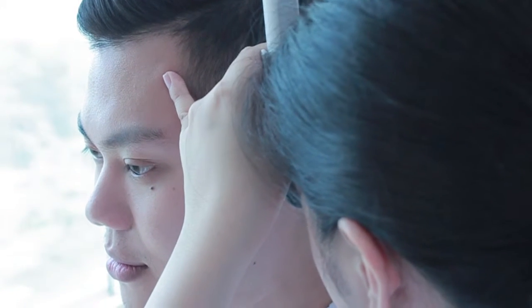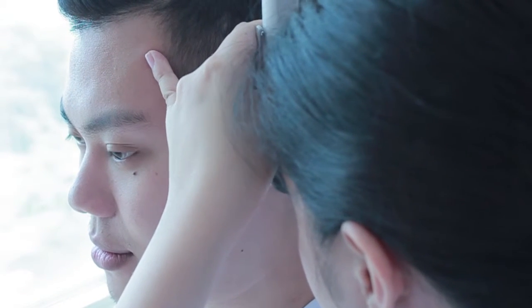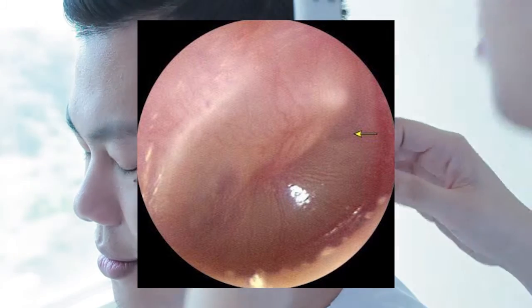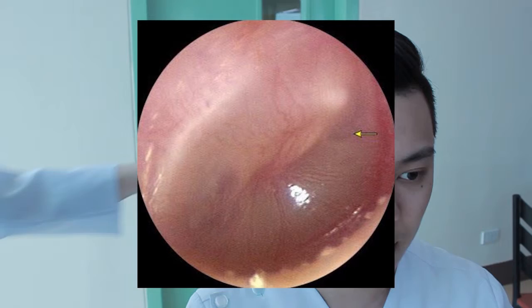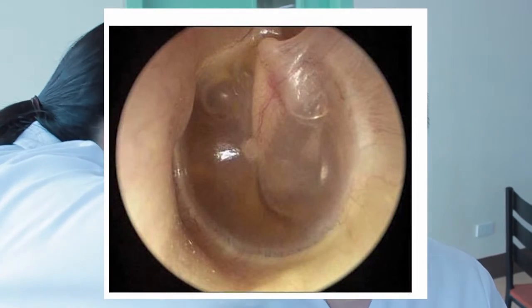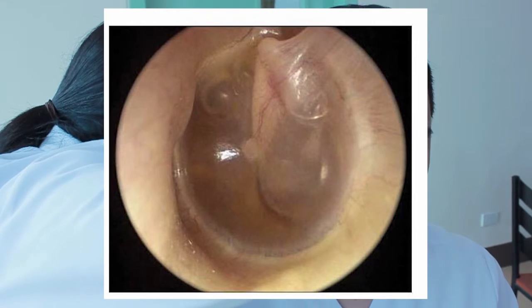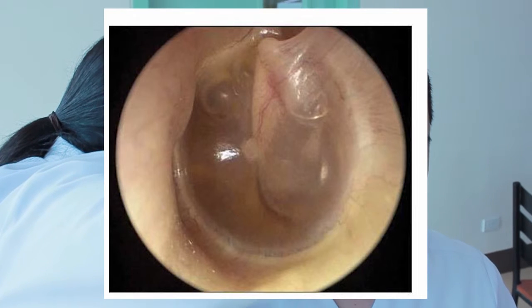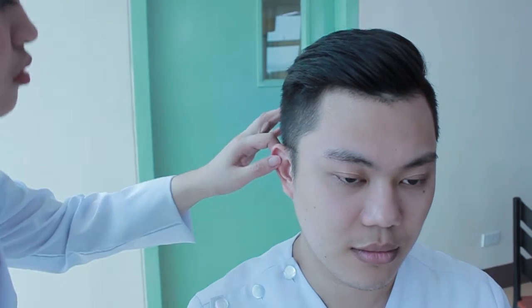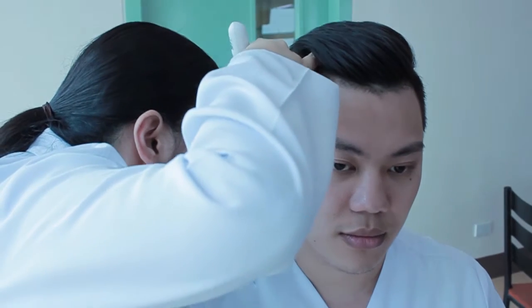A common middle ear abnormality, especially in the pediatric age group, is an effusion, which may vary in color such as yellow, gray, clear, or blue. At times, one might see air bubbles or an air-fluid level. The tympanic membrane may have scarring, commonly known as tympanosclerosis, or it may have a perforation. Because the inner ear cannot be seen, a thorough history is extremely important as well as any other additional information that will be gathered. This is true for both neurosensory hearing loss and vertigo.